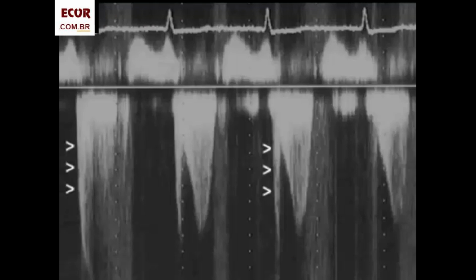This is what occurs by directing the continuous wave beam at the dynamic obstruction at the left ventricular outflow tract. We may also demonstrate a jet of mitral regurgitation, and this is the resultant Doppler. Part is mitral regurgitation and part is LVOT obstruction.